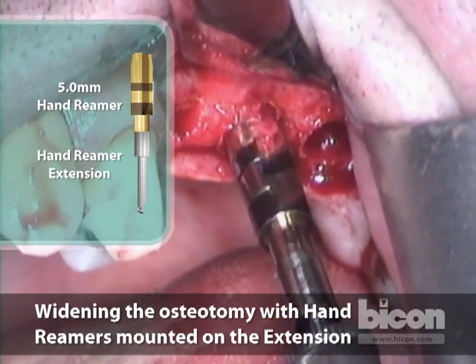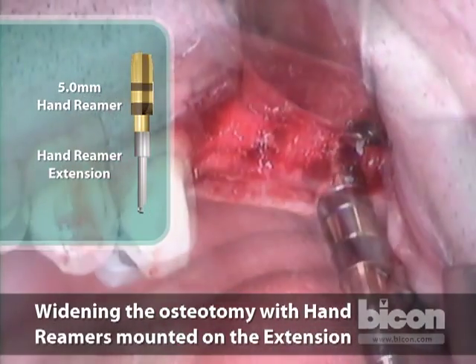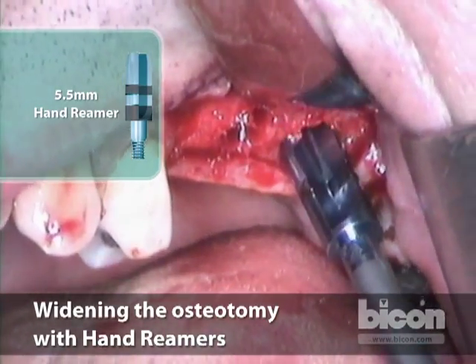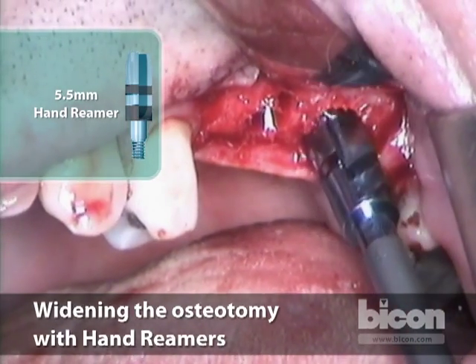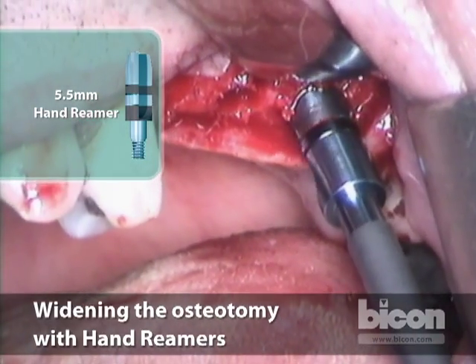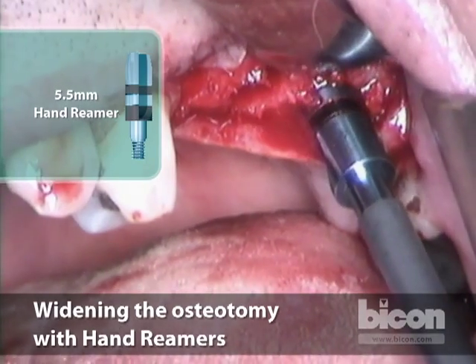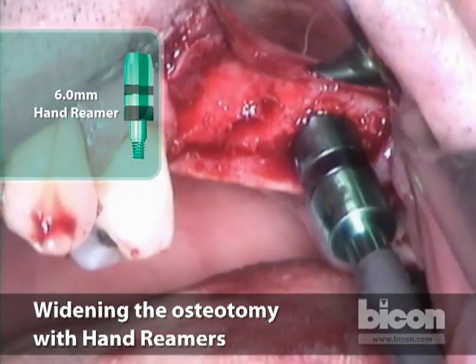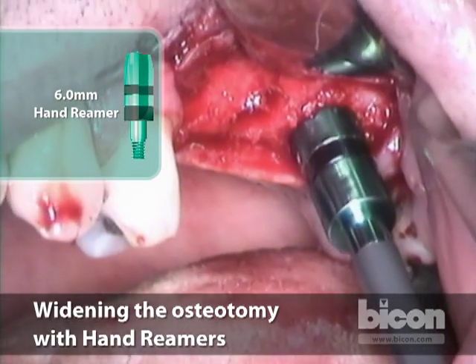I'll apply a little more pressure and shave the bottom a little bit more, making sure not to miss any edge of the bone that may be pretty thin. I'm shaving mostly from the buccal distal corner. One important thing about the hand reamers is that they ream so slowly and gently that even if we remove all of the bone from underneath the sinus mucosal lining, that lining will not likely be torn, because the significant width and diameter won't exert pinpoint pressure likely to tear the mucosa.